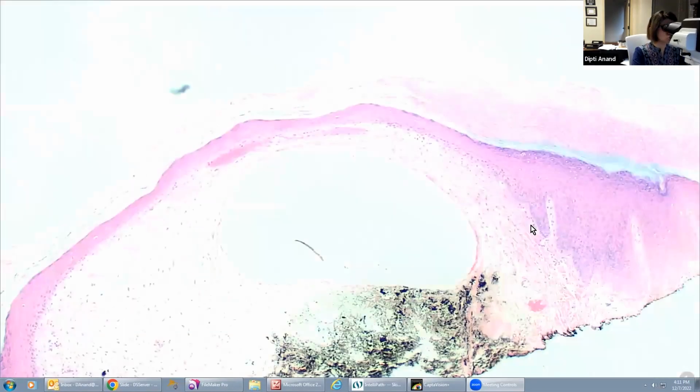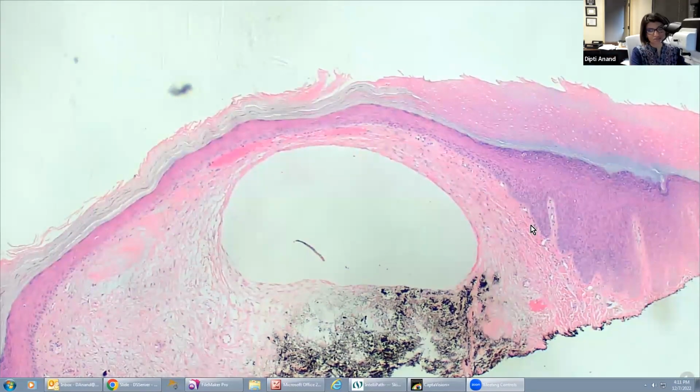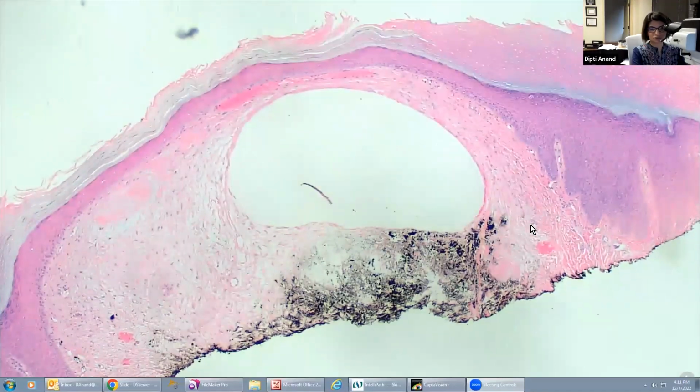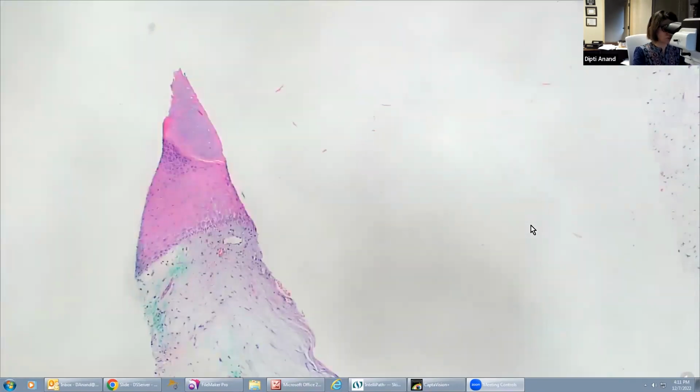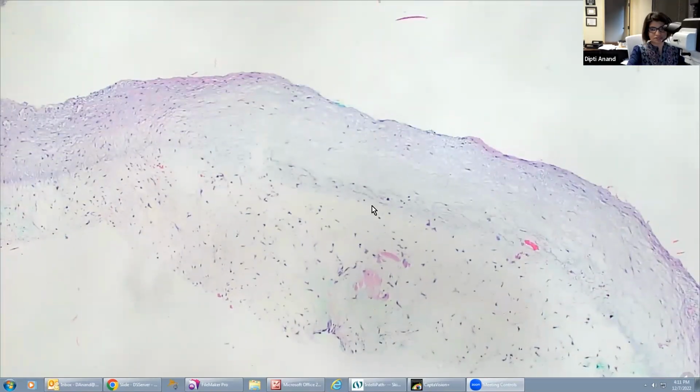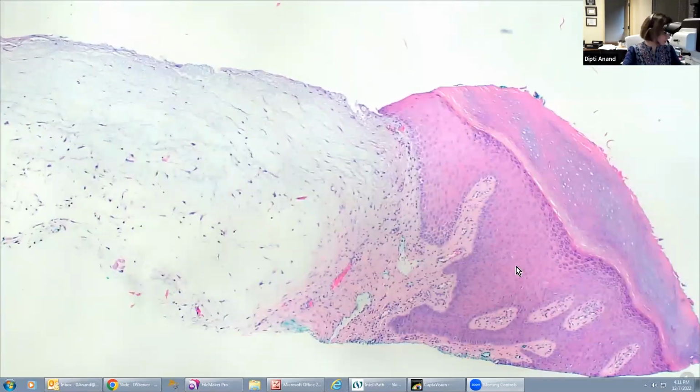This is considered to be the superficial variant of a ganglion cyst, and this is how it classically looks like. This is a digital mucus cyst, or a digital mucus pseudocyst. It is a pseudocyst because it doesn't have the true cyst lining. Okay, this is another biopsy from a digital mucus cyst. This one is showing you the nice mucin without the bubble, but again, you can see the acral skin, and the epidermis overlying it is often thinned out. And you can see this nice mucin with some fibroblastic proliferation. That's again a digital mucus cyst.